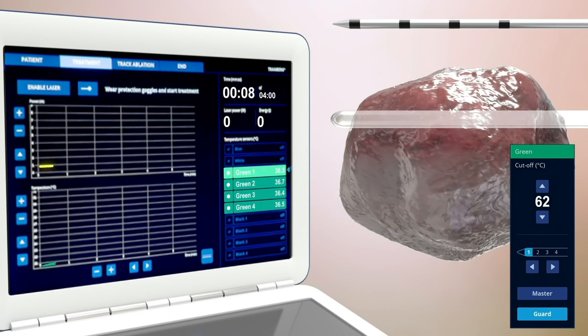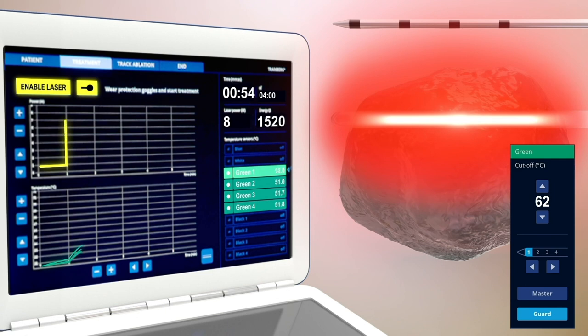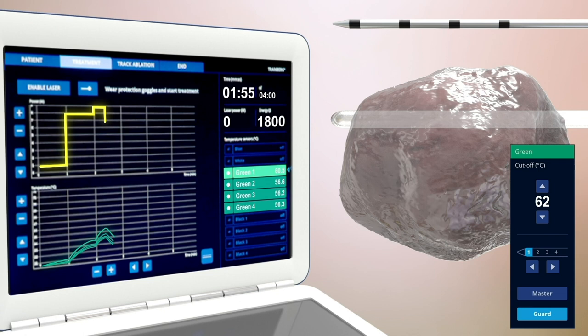A temperature probe is selected as the guard and target temperature is set. Once the temperature is reached, the laser automatically quits emitting and goes into standby.